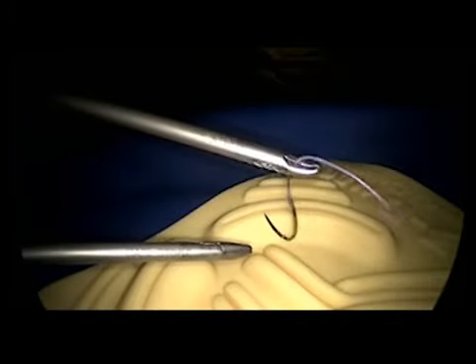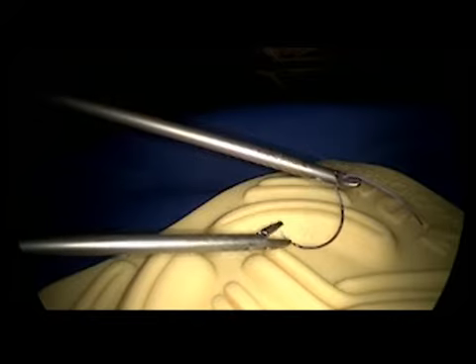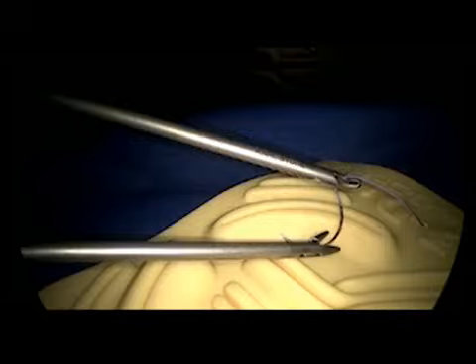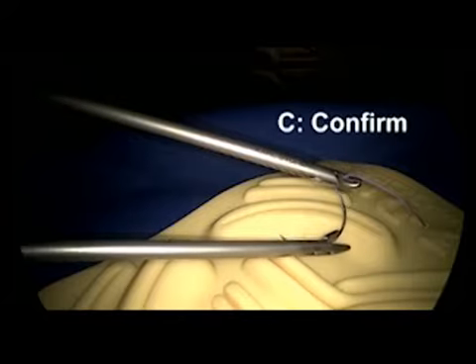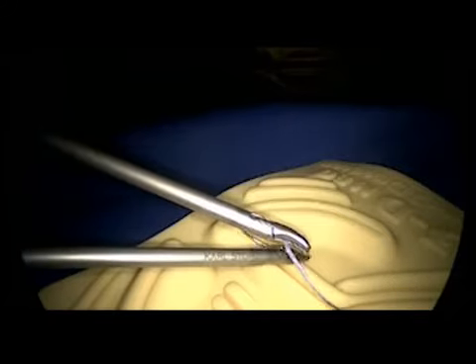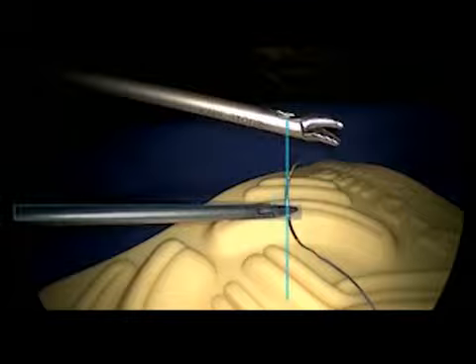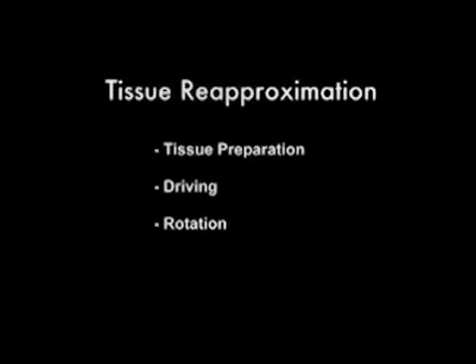Many surgeons use an alternative method to set the needle, where the needle is introduced with the assisting grasper at point A. The needle is then positioned and grasped by the needle driver at point C. The assisting instrument then manipulates the suture until the needle is righted. Once the needle has been set, it can be passed through the tissue.